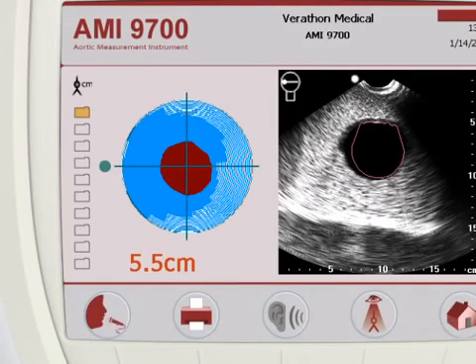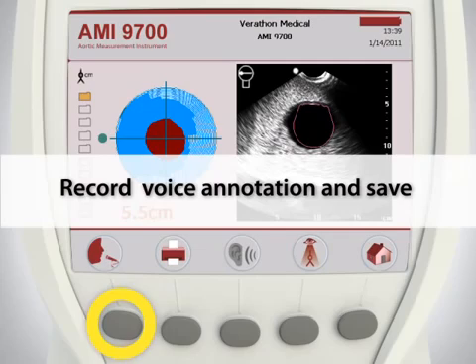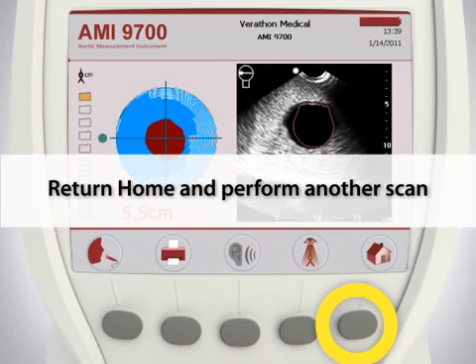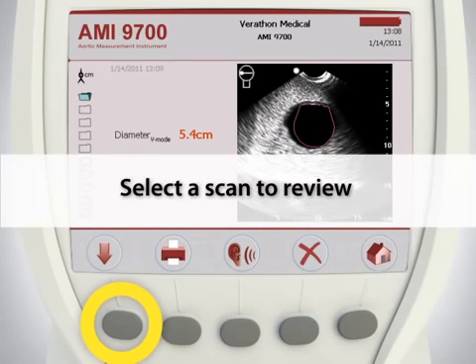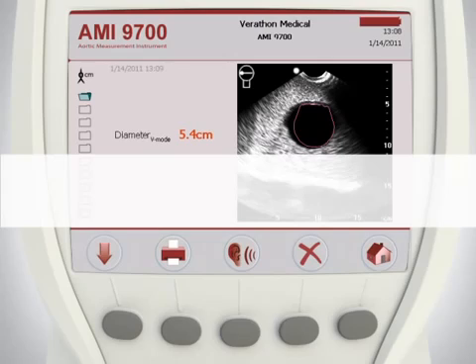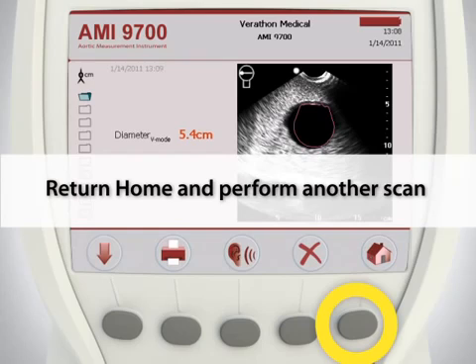When you have verified an accurate scan with no obstruction by bowel gas, choose from the following options before moving on to the next scan location: Record a voice annotation to save your scan. If you do not voice annotate the scan, you must write down the diameter calculated for each scan. Print the current scan using the onboard printer — note that printing does not save the scan. Return to the home screen and perform another scan. To review saved scans, select the Review button. On the Review screen, use the down arrow to select a scan for review. You may print the saved scan, listen to the voice annotation, delete the saved scan, or return to the home screen.